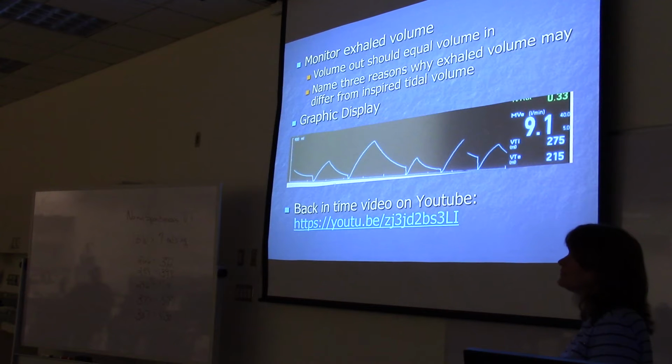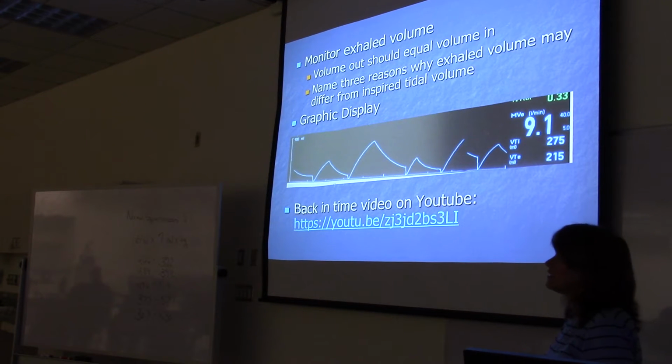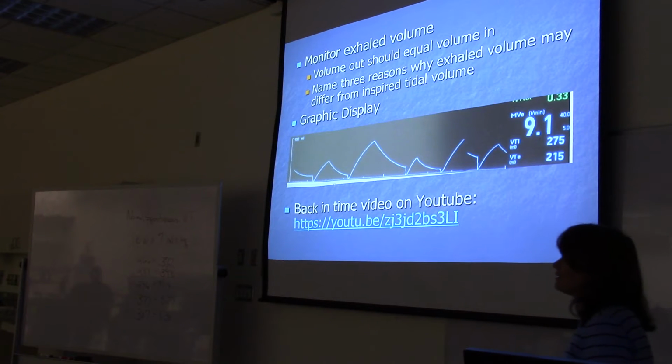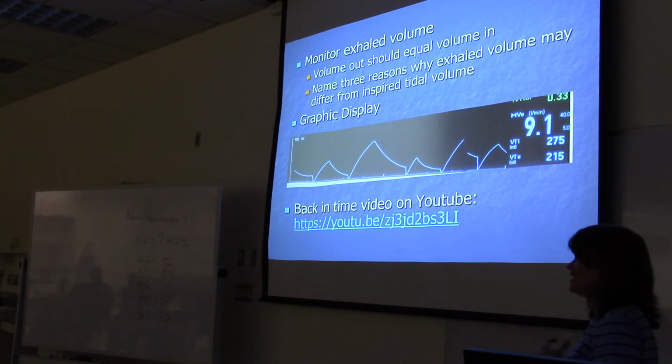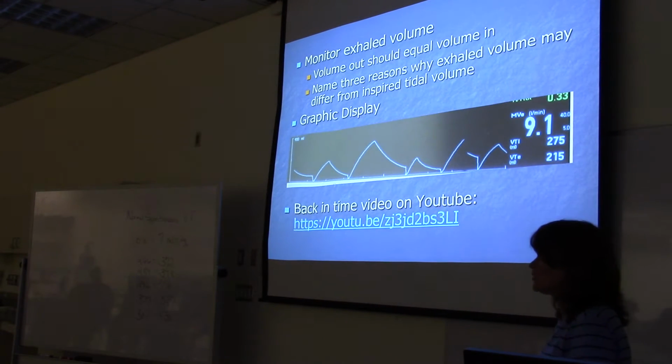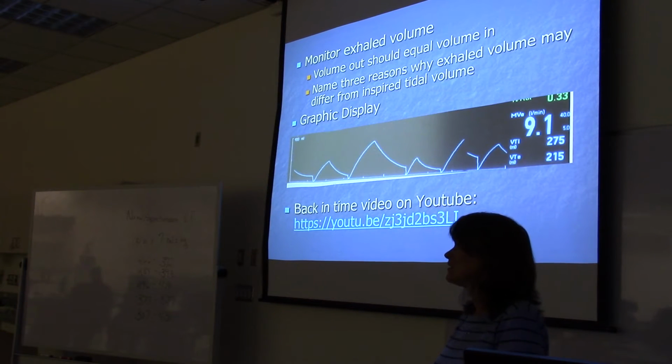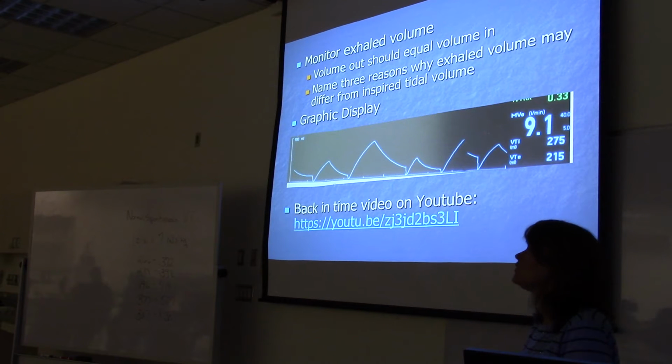Bronchopleural fistula. Yeah. See if the patient has a chest tube in, maybe the air is going out the chest tube. Right. Now, if they did have one, then you can't really control that. You cannot, that's correct.